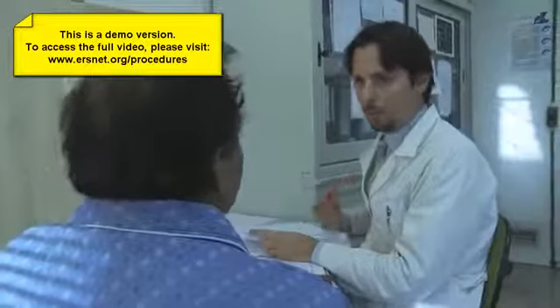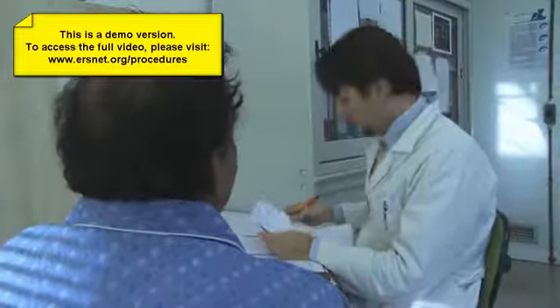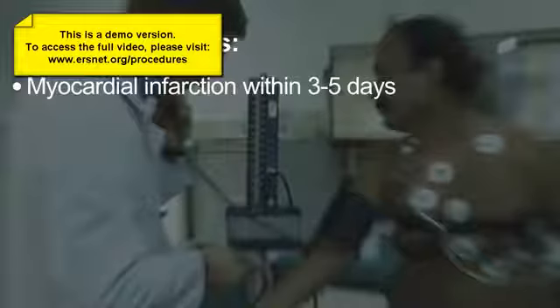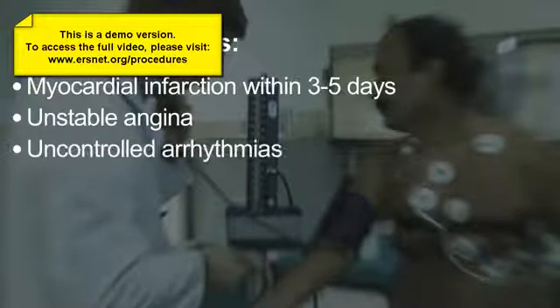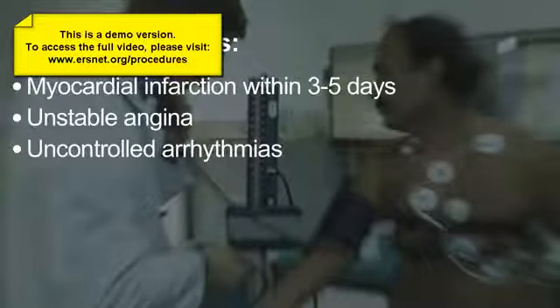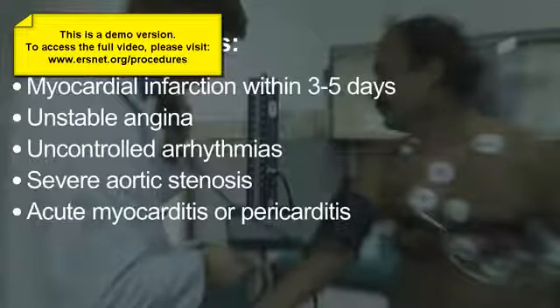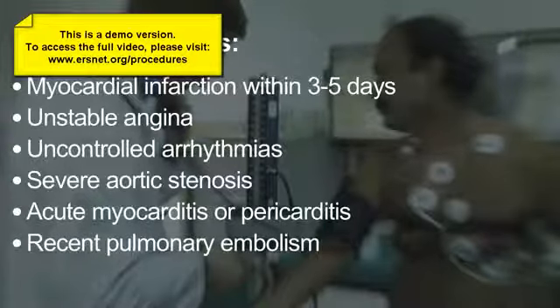By signing an informed consent, the patient should be informed about the risks and the potential discomfort associated with the procedure. The absolute contraindications to CPET are: myocardial infarction within 3-5 days, unstable angina, uncontrolled arrhythmias, severe aortic stenosis, acute myocarditis or pericarditis, and recent pulmonary embolism.